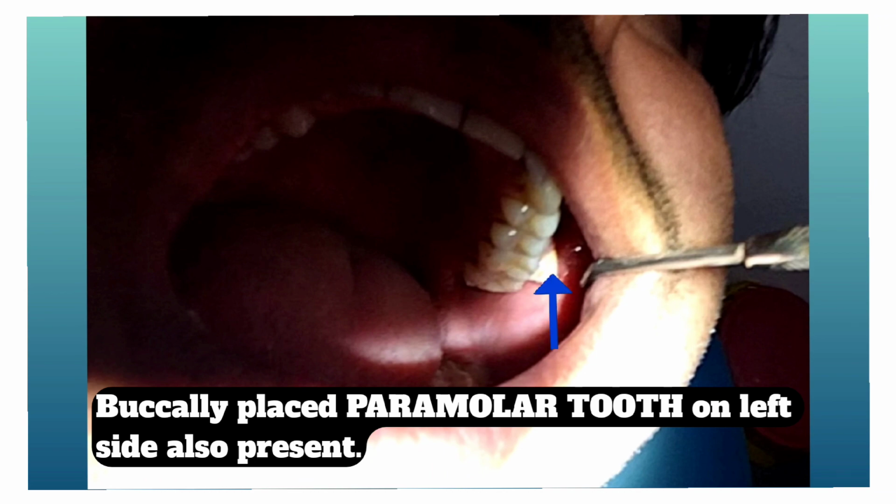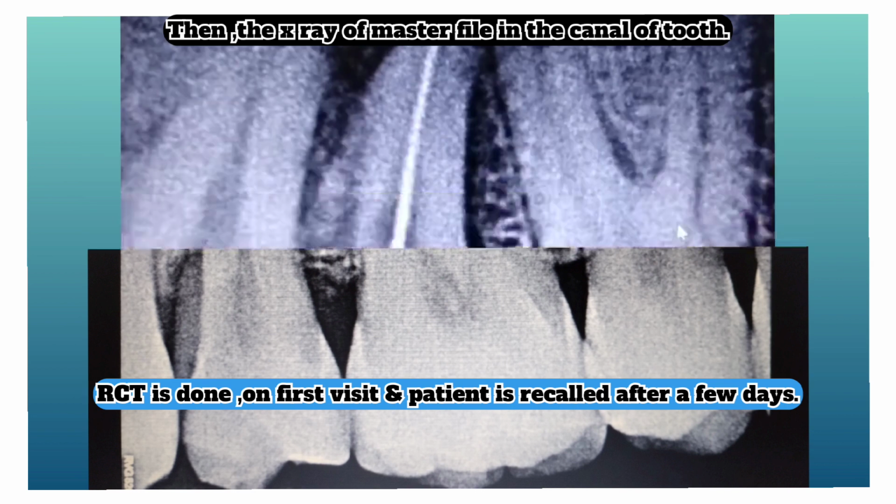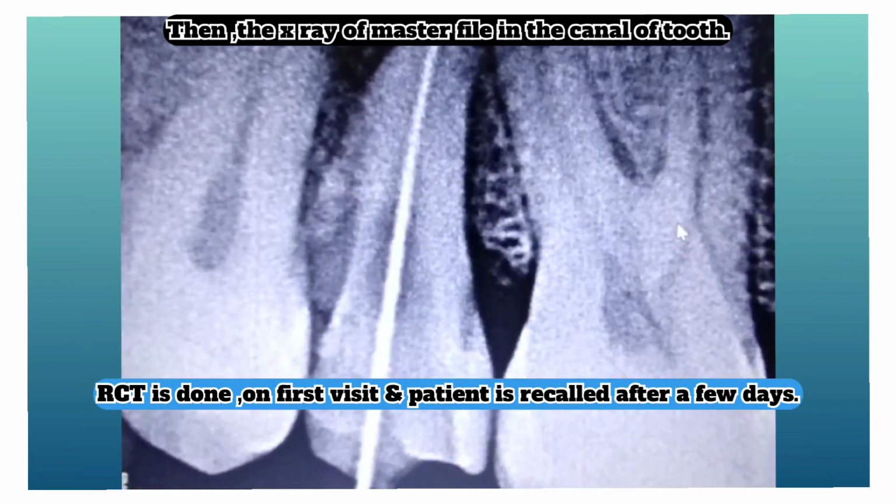We found that the distal side of the symptomatic tooth is carious, through which the infection found its way to the apex of the root, leading to the periapical infection. Then, to save the tooth, we did the RCT procedure on that day.